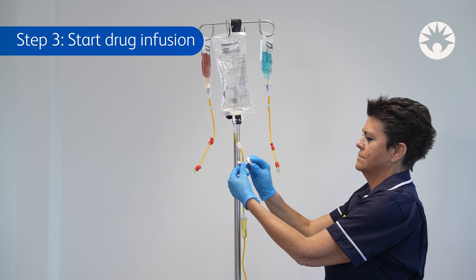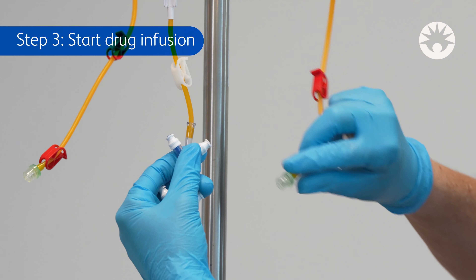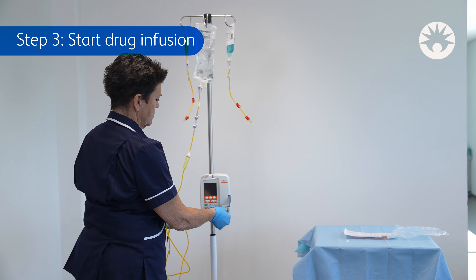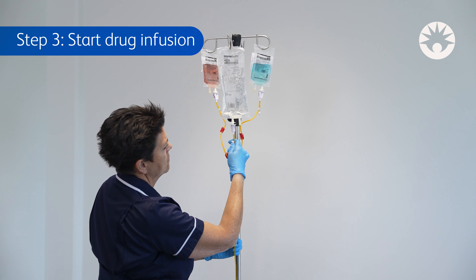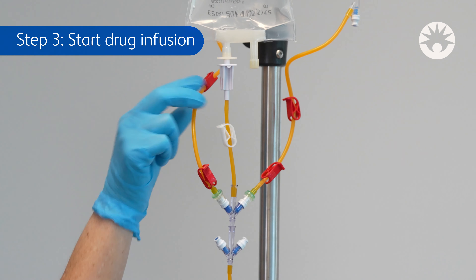Step 3: Start drug infusion. Disinfect the SmartSight needle-free accesses and connect the secondary sets. Connect the primary set to the infusion pump. To start the secondary infusion, close the pinch clamp from the primary set and open the clamps from the secondary set to infuse.